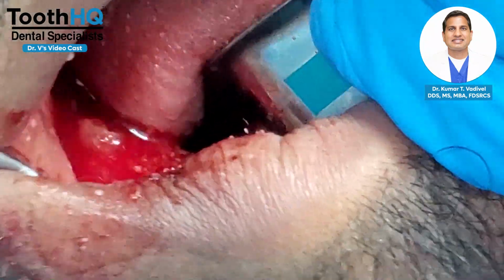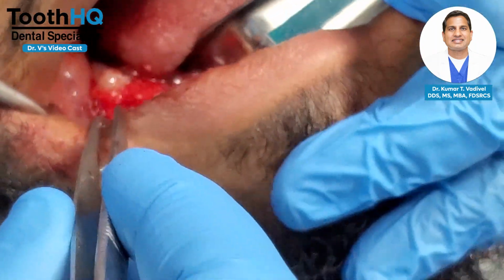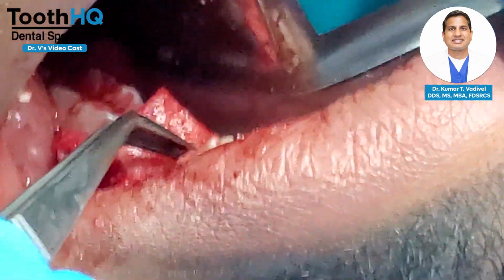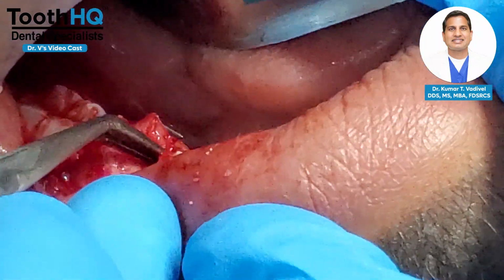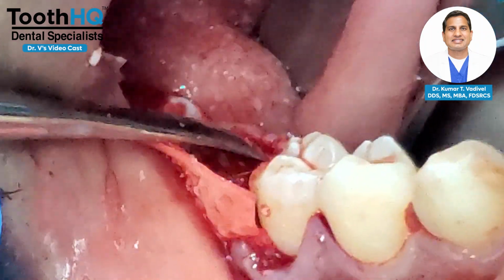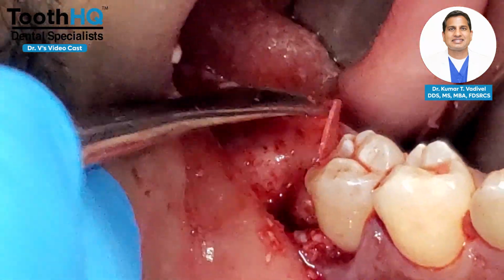So now the next step will be to wrap the membrane up to the lingual and finish up with the procedure. See here? The membrane is here. So what I'm going to do now is wrap the membrane to the lingual flap here. So do yourself a favor, guys, and make sure that you retract the lingual flap here. Okay.